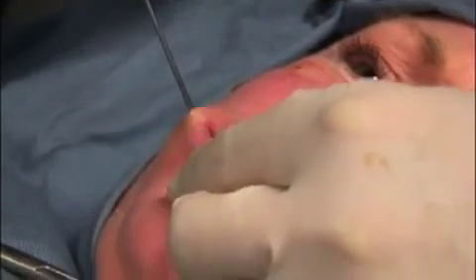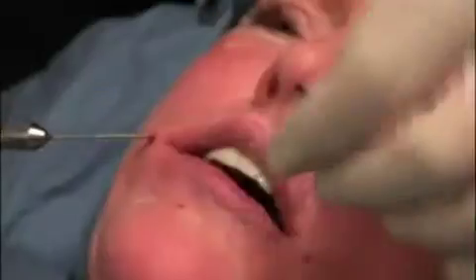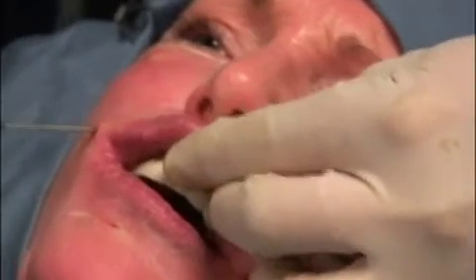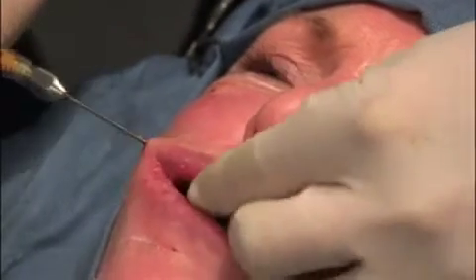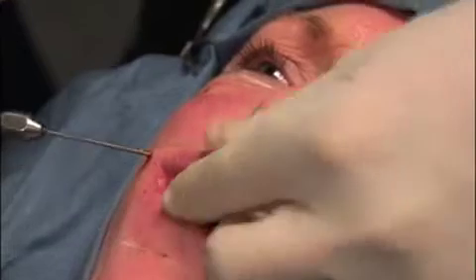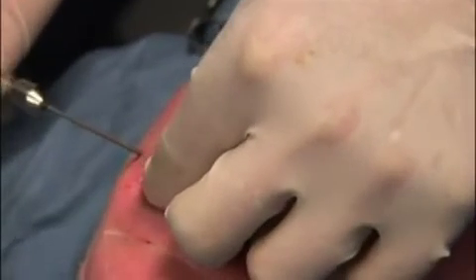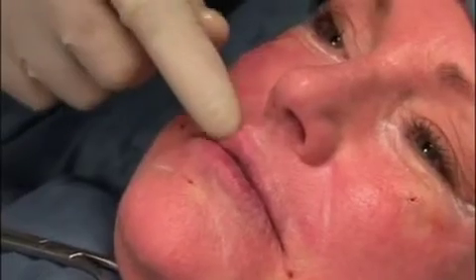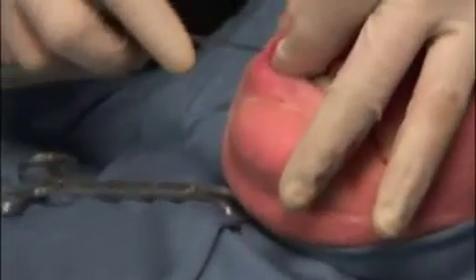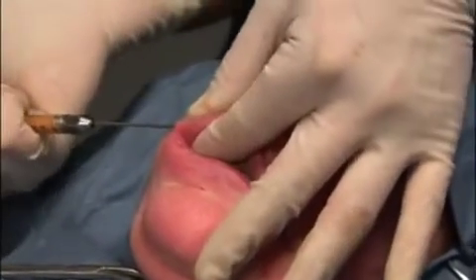Lip augmentation is often achieved through the inferiorly placed nasolabial fold incision for both the upper and lower lip. One must ensure that the upper lip is 2/3 the size of the lower lip. Due to the tight compartment of the lip, rarely can more than 3 to 4 cc's be injected in one entire lip. When augmenting the lips, be very careful not to puncture the inner mucosa, as this can cause extrusion of fat cells through this injury.